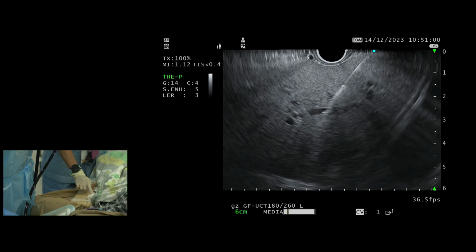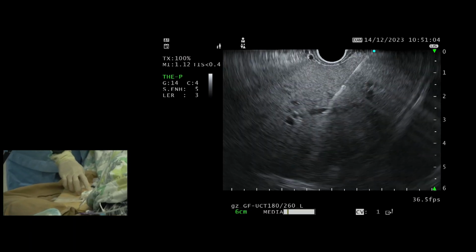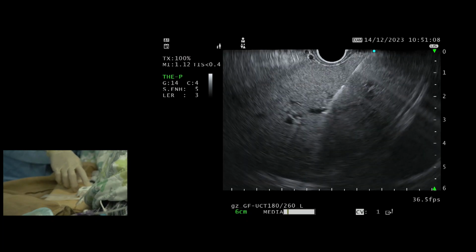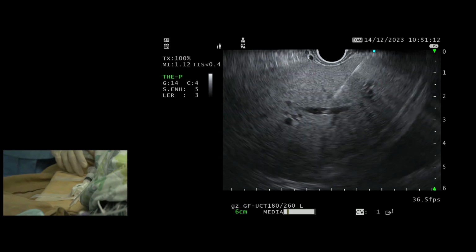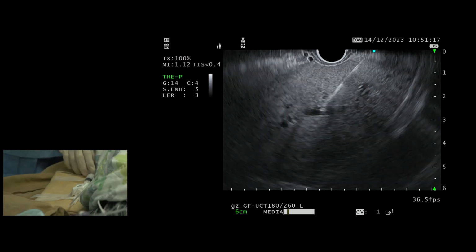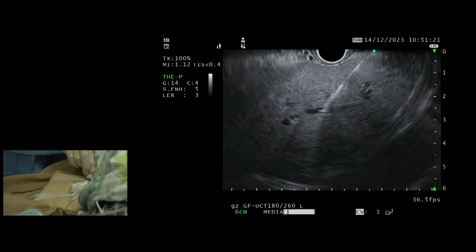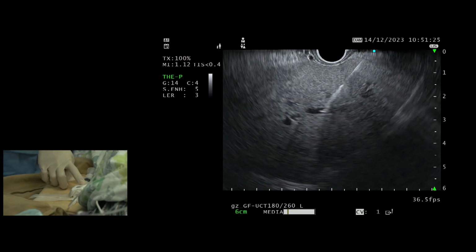And again, we're going to wait for it to stabilize. So it's difficult for us to zoom in, I guess, but I think we trust the measurement. So you wait for 30 seconds to stabilize. What's the reason? Because when we flush the needle, the pressure will go up because of the flush.